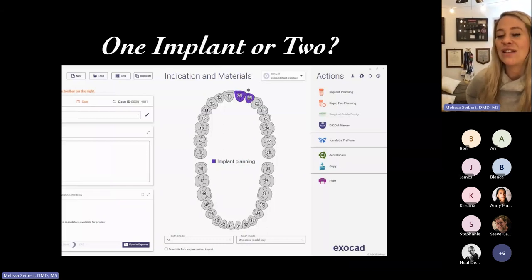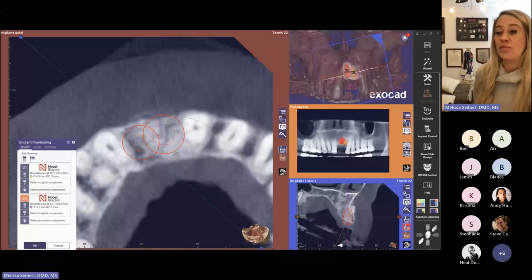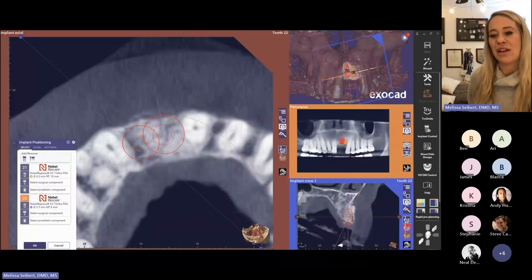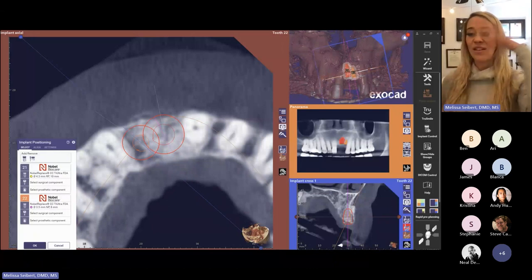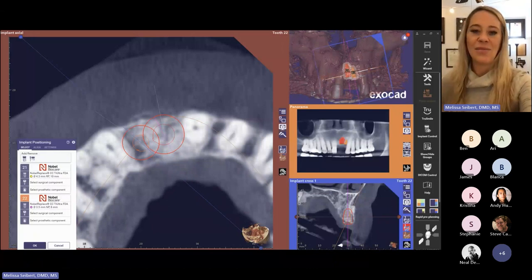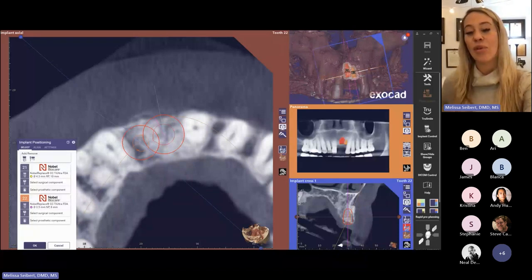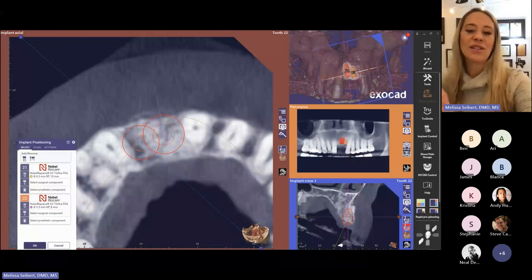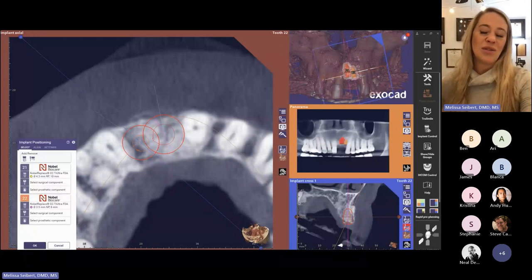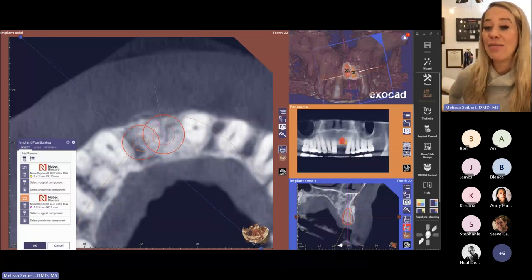I first selected the pre-planning feature to determine if we have adequate space. Now we're in the Exoplan application — Exoplan is generally where we do a lot of our implant planning, while ExoCAD's DentalCAD app is where we do a lot of the design. I did the designing in DentalCAD and then transferred that and brought it into Exoplan, although you don't always have to do that. You can design the case in Exoplan, although some features are more limited there.